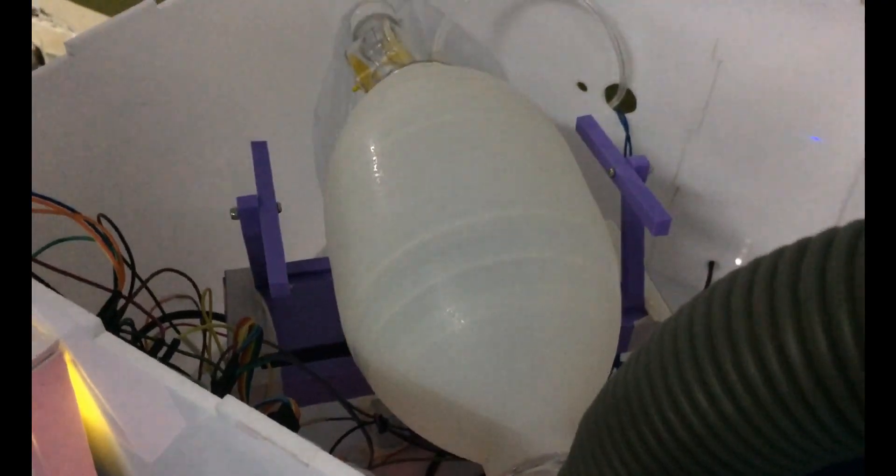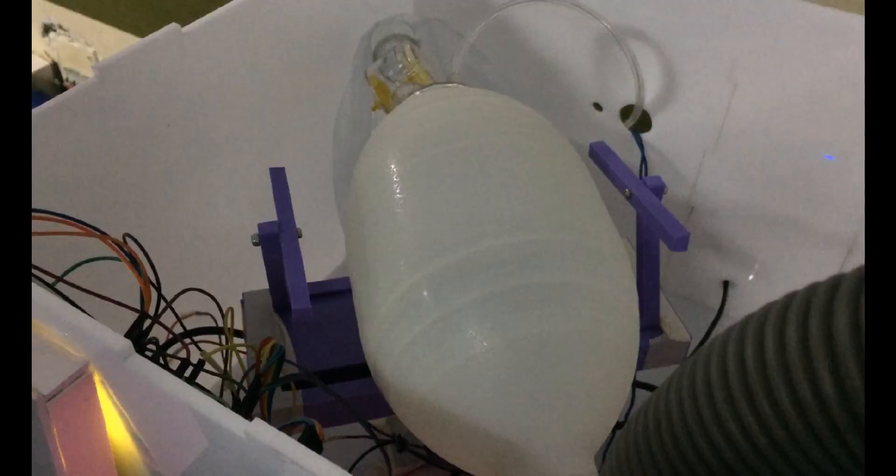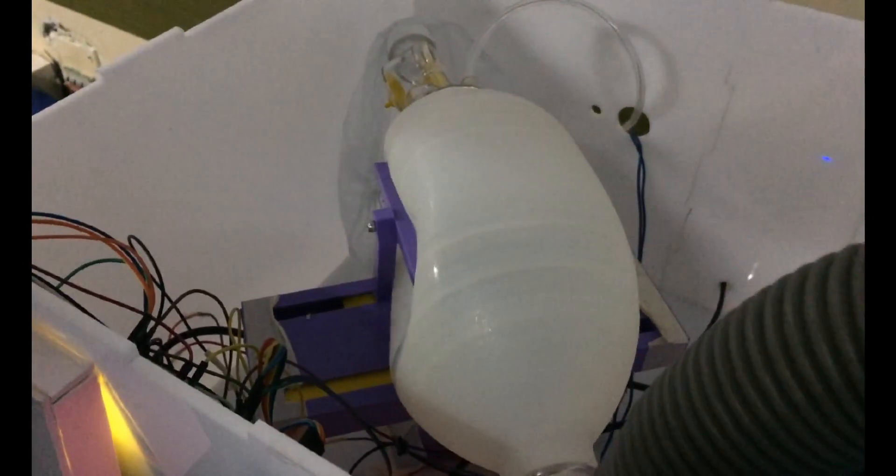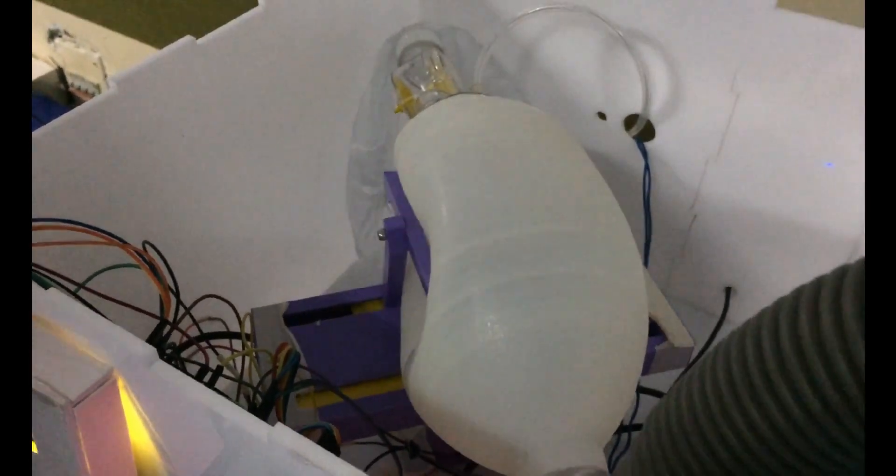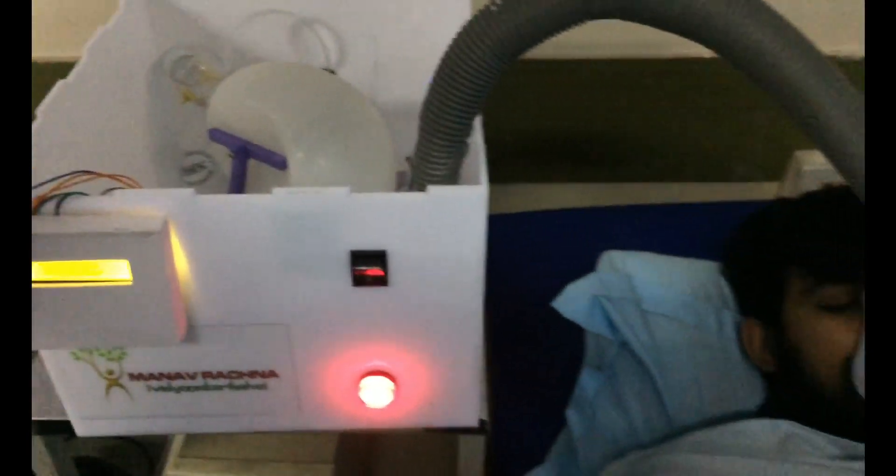When you see the demonstration of this particular ventilator, you can see that there is a robotic mechanism which is pressing the AmboPad, and with this press, the oxygen is being fed to the patient who needs it.